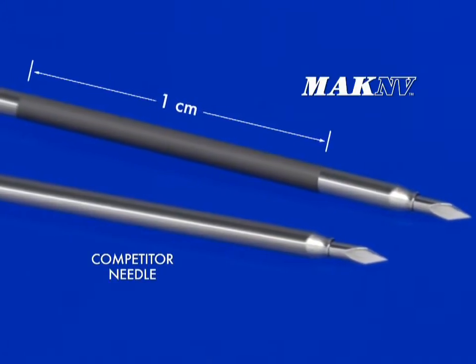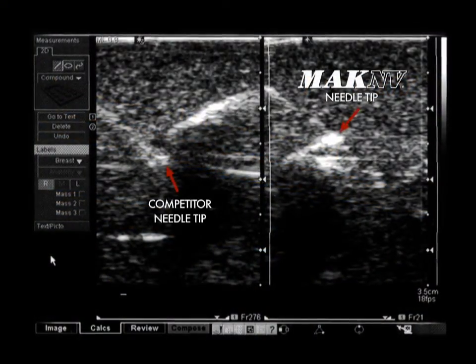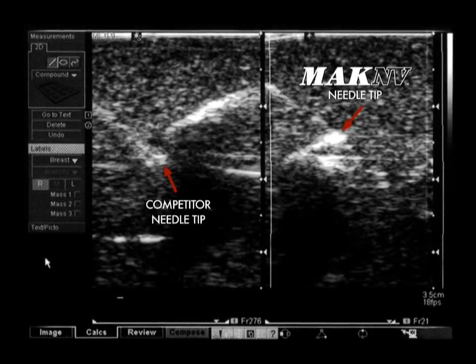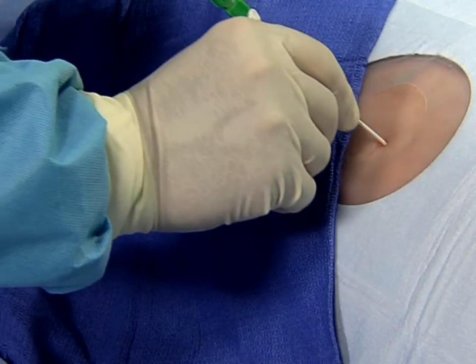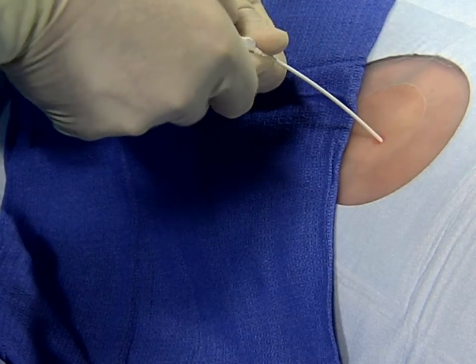For better visualization when using ultrasound, the MacNV needle has one centimeter of echo enhancement at the distal end. Without echo enhancement, other needles may not be as easy to visualize when using ultrasound guidance.